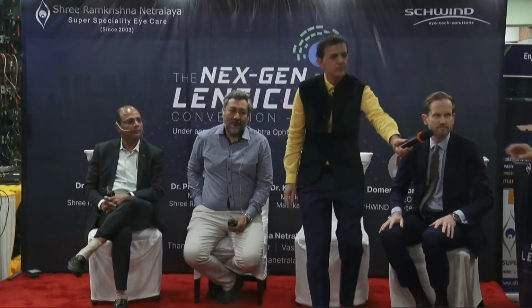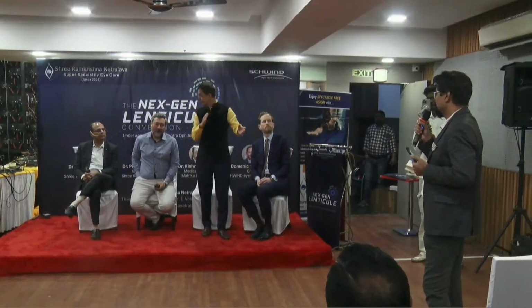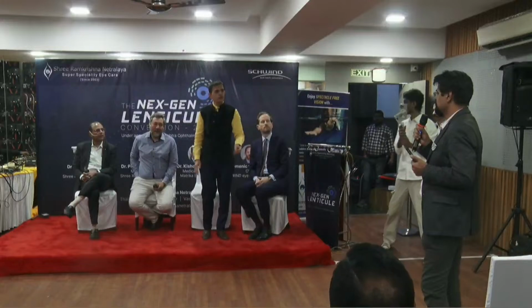We have a senior refractive cataract surgeon from Pune here, Vittal Satha. Vittal, what will be your cutoff for pachymetry? For PRK, I keep residual 400. The calculation is like this, 400 should be the residual for PRK. No, cutoff, pre-op, total pachymetry.